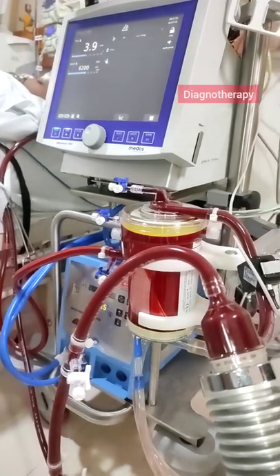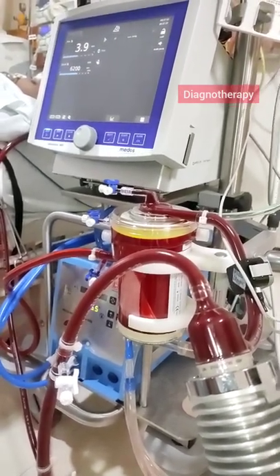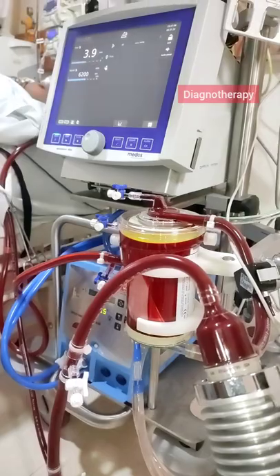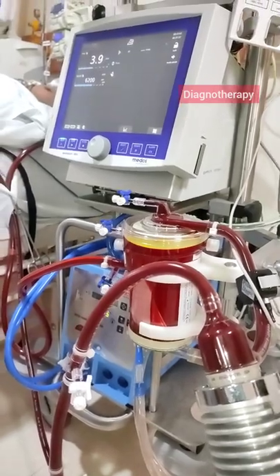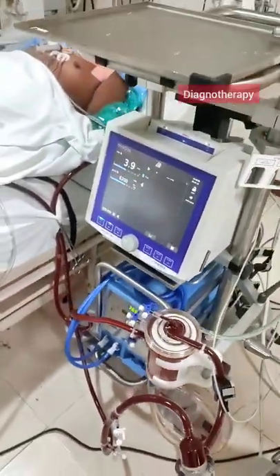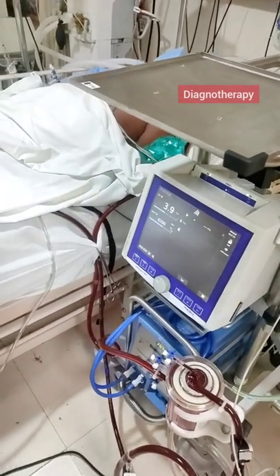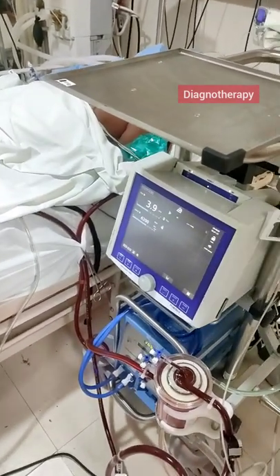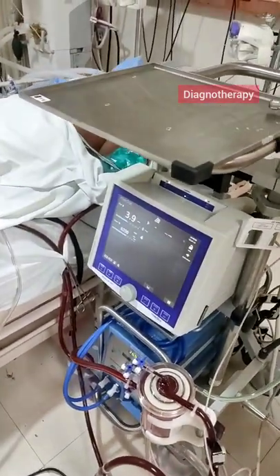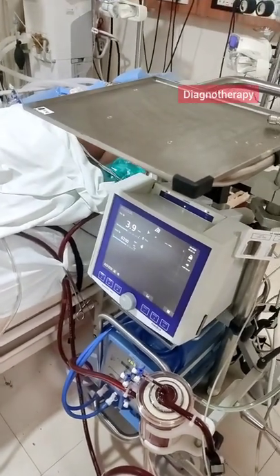The cannulation is done by proficient surgeons and doctors. This machine is operated by perfusionists who are well versed with the machine and its operation. They continuously monitor the machine and depending on that the clinical decisions are made.